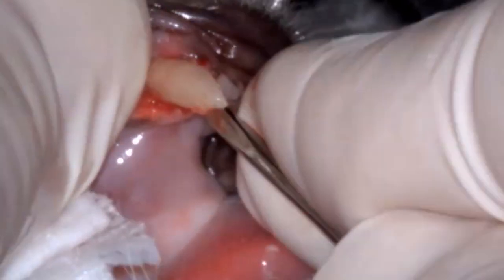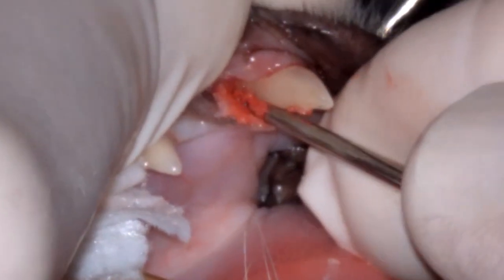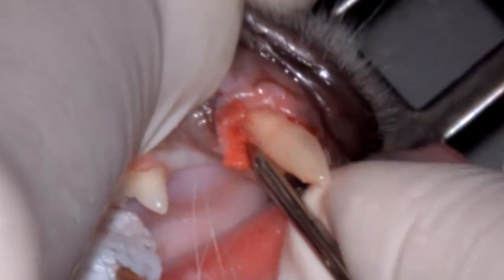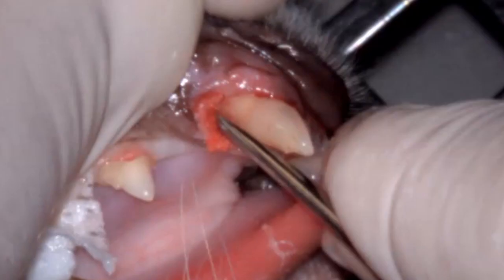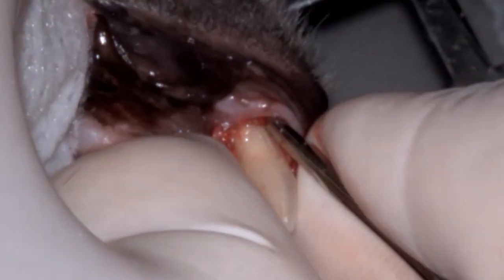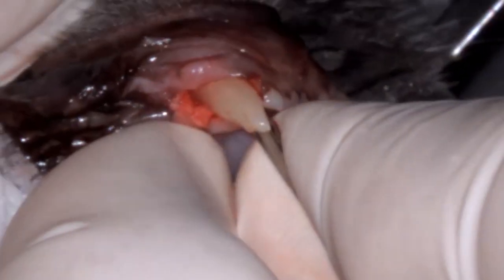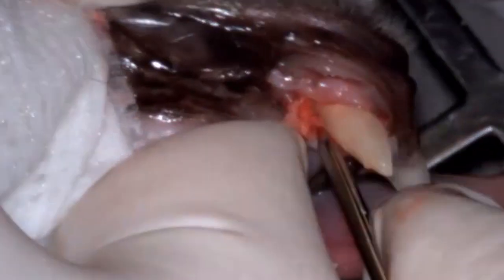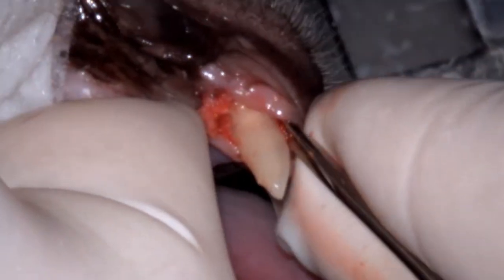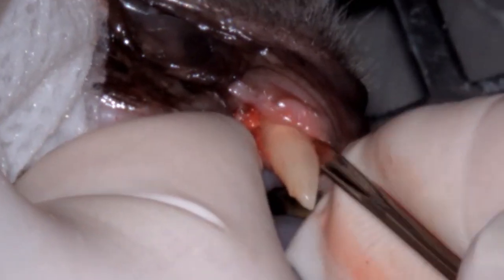In this particular instance, the radiograph suggested we might get the tooth out in one piece, but as you can see from the amount of time I'm taking and not getting much movement, this tooth is starting to act like it's not going to come out intact. The challenge with extracting any tooth — certainly a large one — is applying sufficient force to loosen it from the socket, but particularly with lower canine teeth in cats we must be careful not to apply so much force that we fracture the jaw instead. Of all iatrogenic jaw fractures during tooth extraction, the cat lower canine is most likely to result in a crack or fracture through the socket.